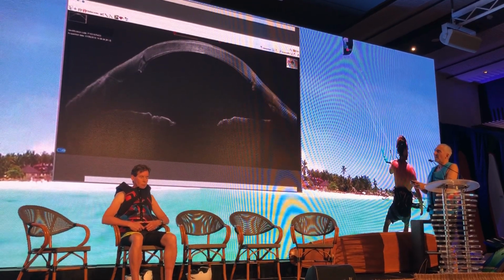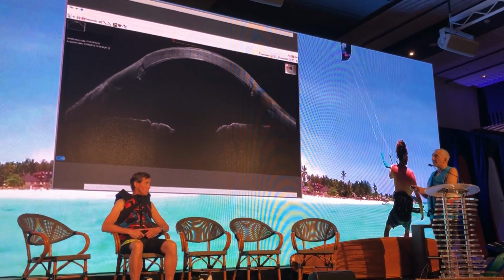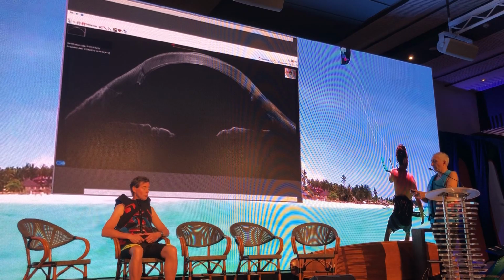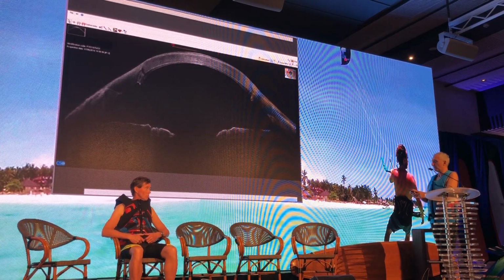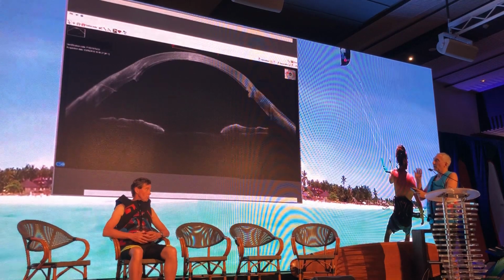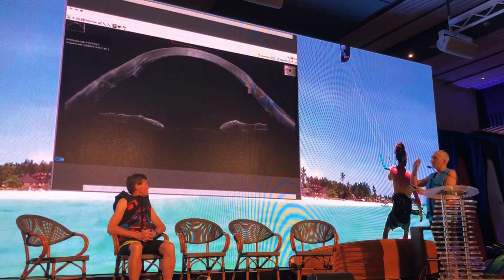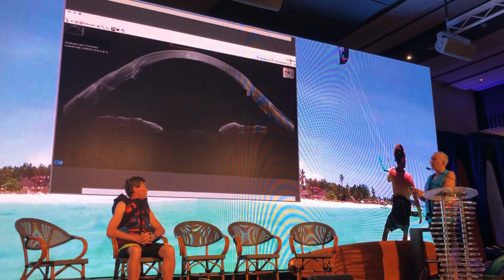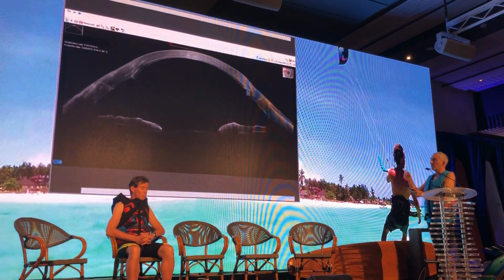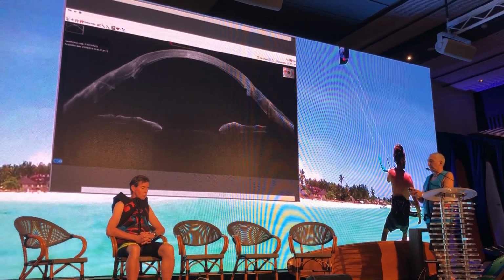In fact, I asked the patient, who didn't tell that to me before, and he admitted that he had PRK after the PK many years before, and so it was very useful having the epithelial map to compensate for some unusual thickness of the epithelium. And we made a custom PRK, and the patient, besides he has quite a cataract, went very well.